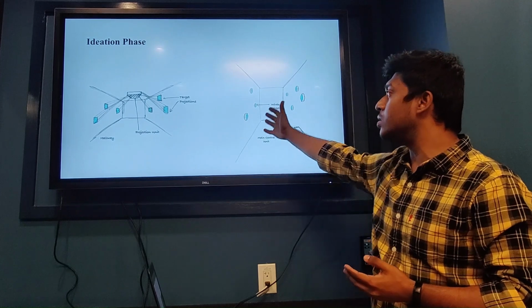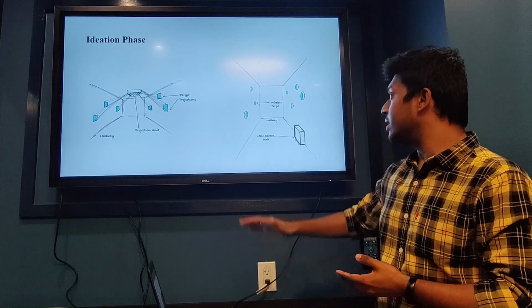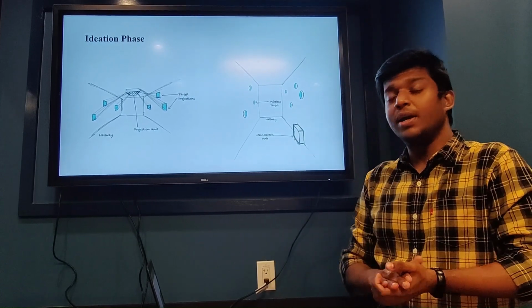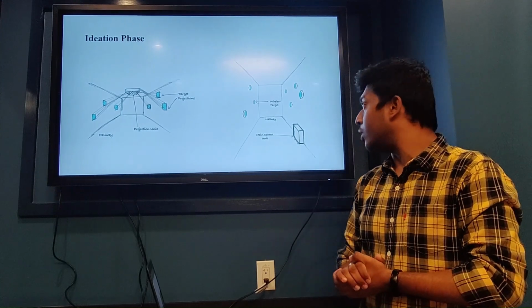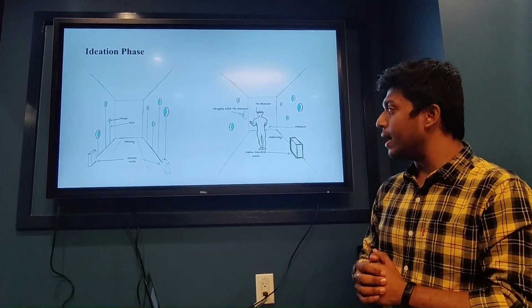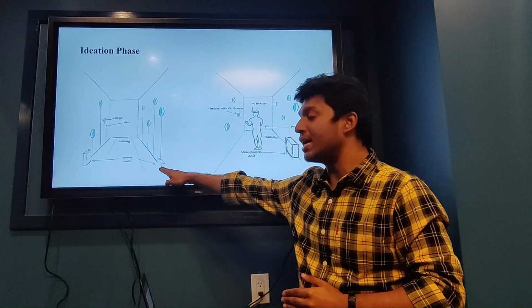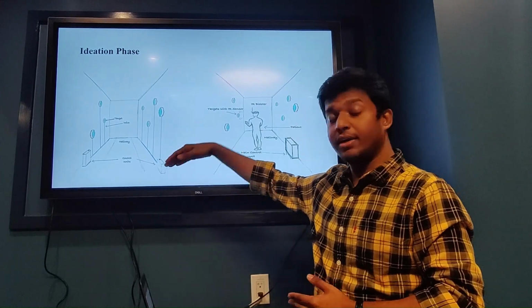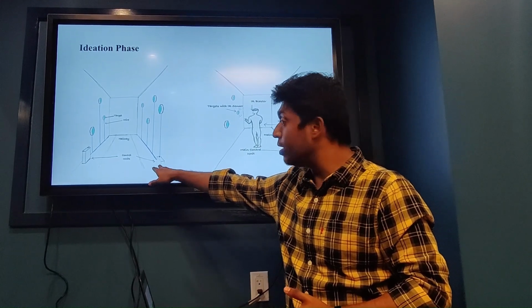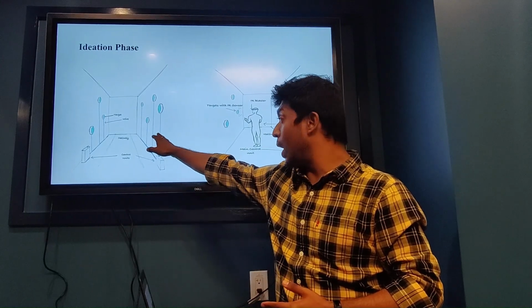It's very similar to how the Blaze Pods would look in a therapy session, in the sense that they're wireless, and they have one main control unit, which would typically be an app on a phone or a laptop. So we moved on to build upon that idea, and we decided that it would be more feasible to come up with something wherein there are secondary control units that are connected to the phone or the laptop, and these secondary control units are connected wirelessly, but they are connected to each display with a wire.